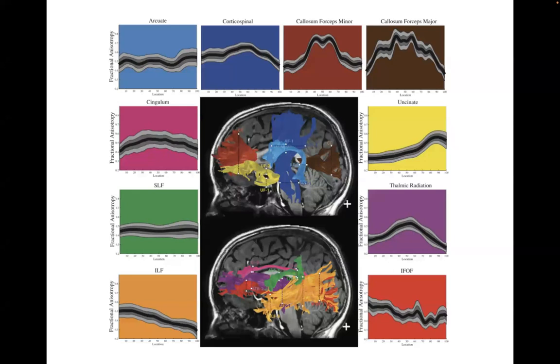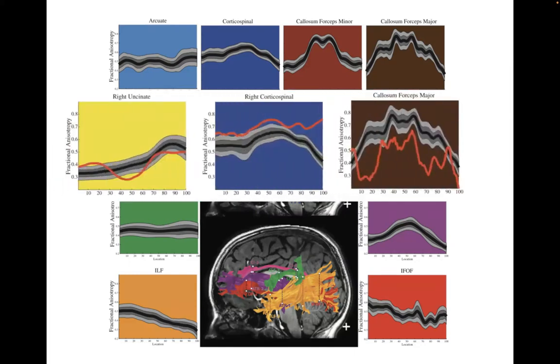And I think this is also a very hot topic for medicine, and with the company we built, we're starting to bring this to the market and to the clinic, a little bit like when we bring our kid to the hospital, to the pediatrics, and we measure them and we put them on a curve. Now we're building normative references from 20 years old to 90 years old of what is a healthy white matter. So that if you have a concussion, a stroke, or you show up to the ER and you're this red curve, we can actually map where you are. What is the condition of your white matter with respect to a normative reference?